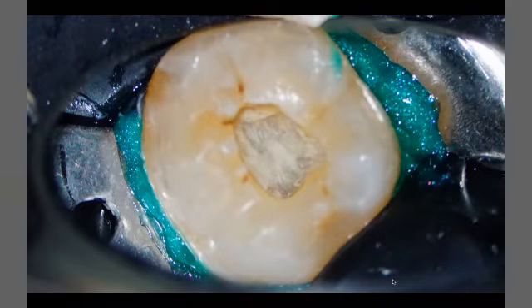In this stage of access, you have to take multiple periapical X-rays to check clearly that you are centered and not going beyond the floor. You are not going very deep. Because if you go deep about 1 millimeter and start going mesially, distally, buccally, lingually, as usual, you will lose the floor map, which is the most important thing to get back to the root canal orifices, because we need the floor map to guide us to them.